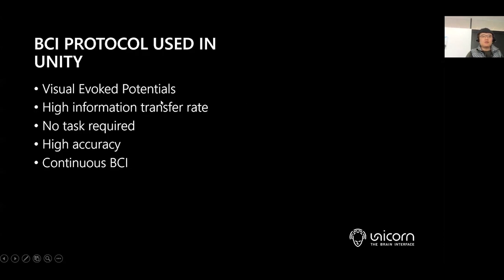The protocol that we are using has a high information transfer rate, and you don't have to do any task while focusing on the stimulation. The accuracy is pretty high, and the BCI selection is continuous.